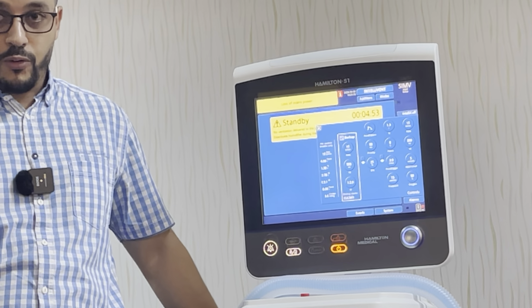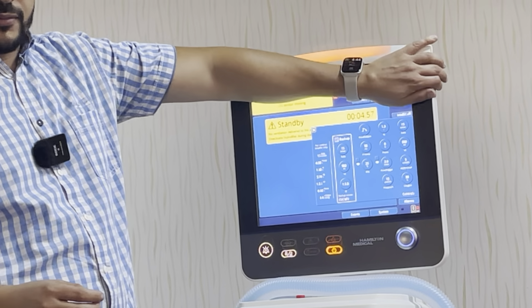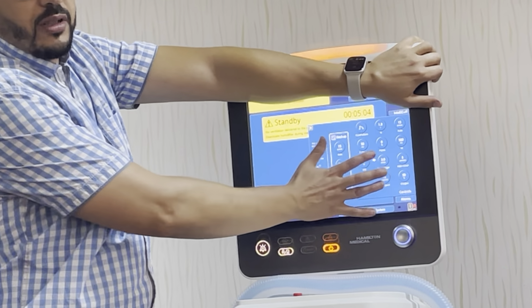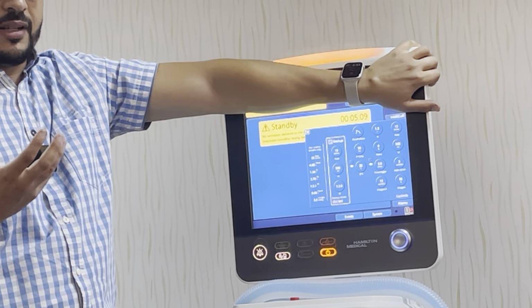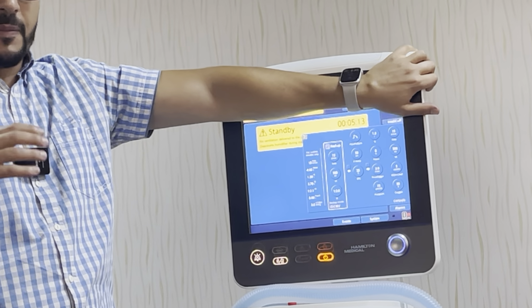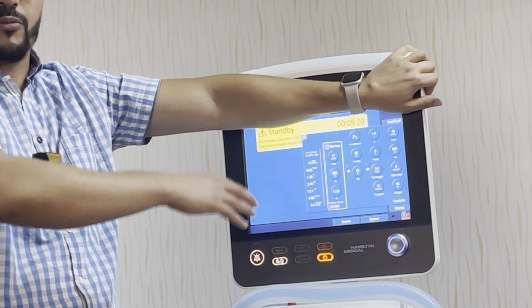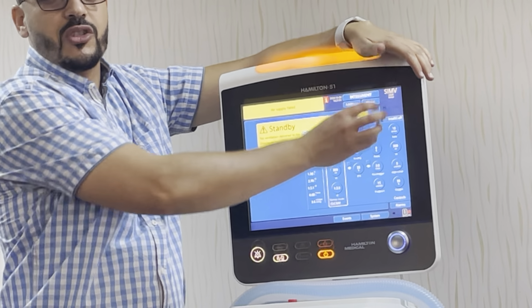هي شوف مفروض اي دكتور تخبي له اسم المود، تفتح له الويندو بتاع الكنترول، ادوات التحكم هذه ما عادش يهمك المود هلبة. هذوما اللي باش يعطيوك انت شنو بتشتغل، الادوات التعديل. ما المود ما يفرقش هلبة. علاش بكري قلت لكم الفرق بين السي ام في والاس اي ام في الاساس ما فيش فرق. انا نقدر نوصل للتارجت اللي توصل لها انت بالاس اي ام في، نقدر نوصل لها بالسي ام في، واحد ثاني يقدر يوصل لها باسيستد كنترول او باي مود ثاني. فهي الفكره هاو يو ماستر البارامتر مش اسم المود.